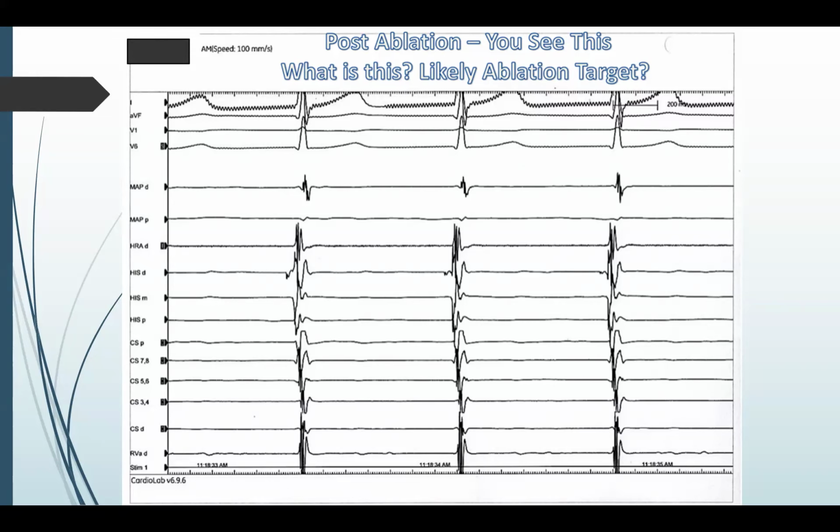Then the atrial lead senses the retrograde A and then paces the ventricle to it, so that you have a form of tachycardia where the antegrade limb is through the pacemaker and the retrograde is through the AV node. Pacemakers actually have features to interrupt that from happening by lengthening certain intervals intermittently. But the point is, the fact that that can even exist is a good indication or proof that you can sometimes have antegrade block, but still have retrograde conduction.